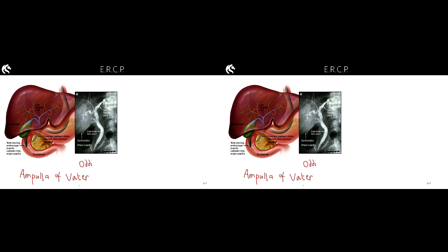It's really challenging. The worst part about it is endoscopes don't have a camera on the end of them. They have a camera on the side of the end of them. Okay? So it's the equivalent of trying to walk your way through a room, but you don't get to look forward, you only get to have a look at the wall alongside you. Okay? A really challenging sort of undertaking.